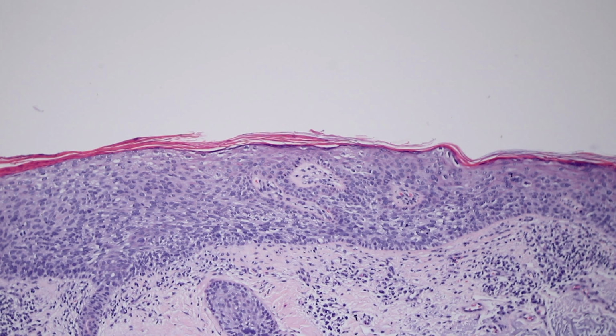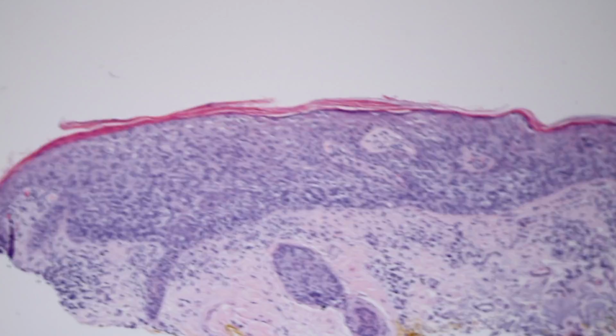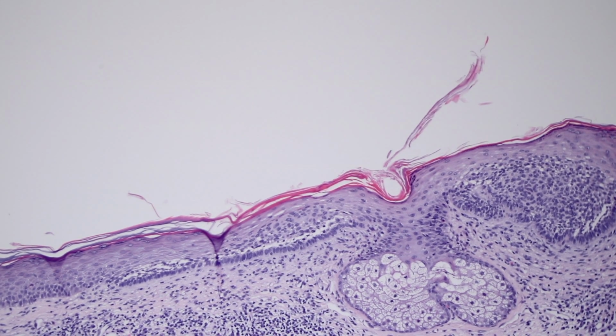If you're having trouble, and again, it probably doesn't matter for clinical care, BEREP4 will usually stain basal cells very strongly and doesn't tend to stain squamous cells nearly as much. So in difficult cases, rarely would you need that clinically, but if someone said you really need to tell, BEREP4 could help you sort out a squamous in situ from a superficial basal. I've seen that a couple times where it actually was useful and made a difference. Okay, a couple other variations here of squamous in situ.